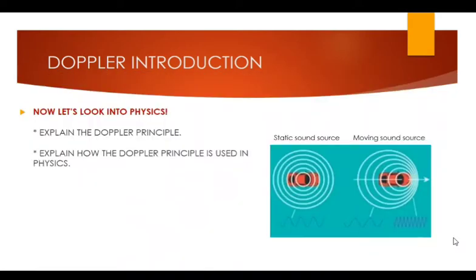Okay, so the next question we need to really ask ourselves is, what is Doppler ultrasound? In the most basic terms, it is imaging flow. And it's based on high school physics, which is the Doppler effect. So I do really think it's important, especially for someone like me who never had a background in physics at all, not even in high school, to go over this principle. For some people it might be basic, and if it is, feel free to skip this part of the presentation. But I'm going to explain it for people like me, because that's who I made this video for.